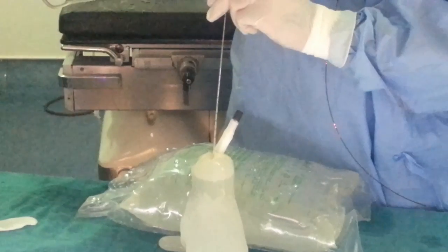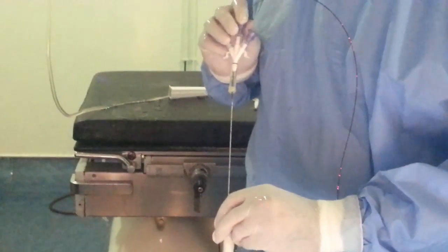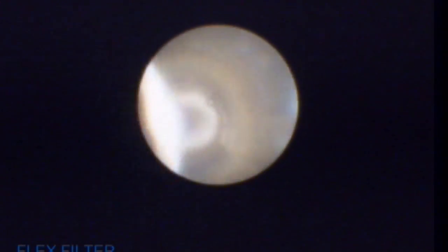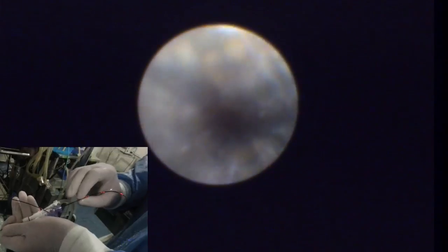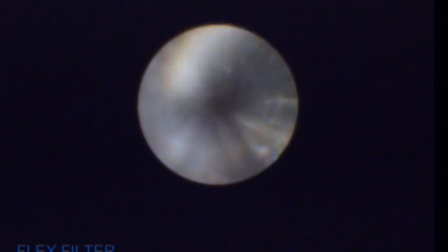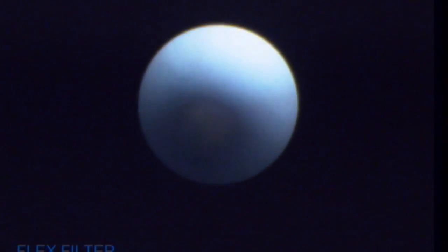The needle is advanced through the implant sheath. The visualization fiber is introduced into the needle. Endoscopic view of the needle. The visualization fiber is advanced into the needle until reaching the implant sheath. The needle is then advanced into the implant sheath and the glove.